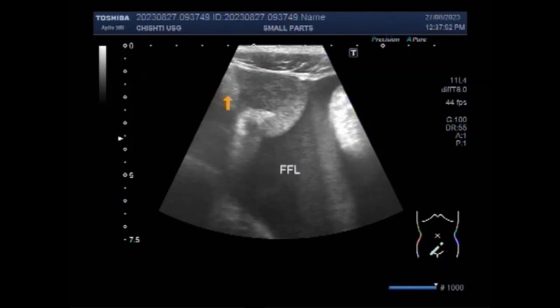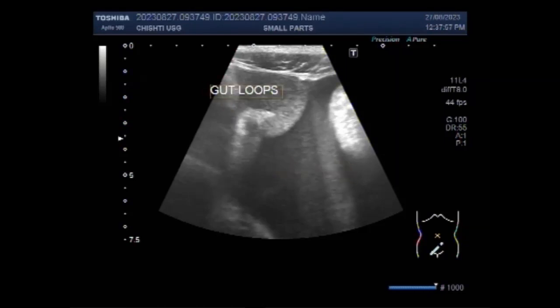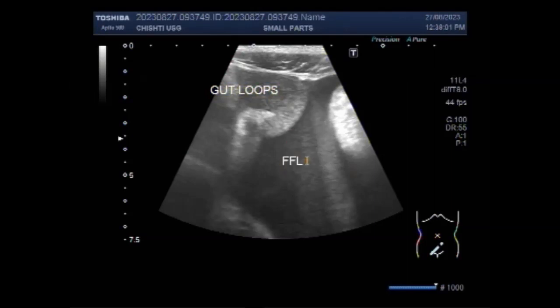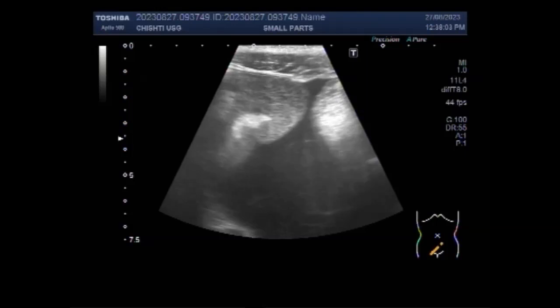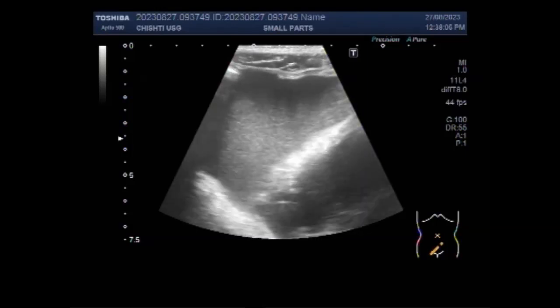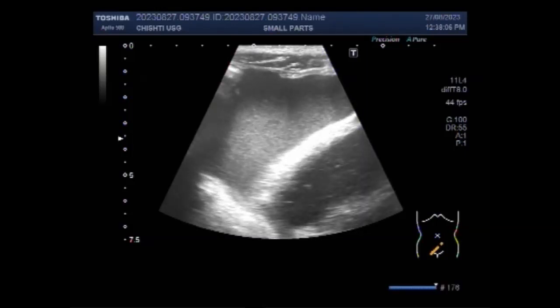Now you can see the gut loops and free fluid. A perforated bowel is a medical emergency. Left untreated, it can quickly lead to sepsis, organ failure, shock and even death.